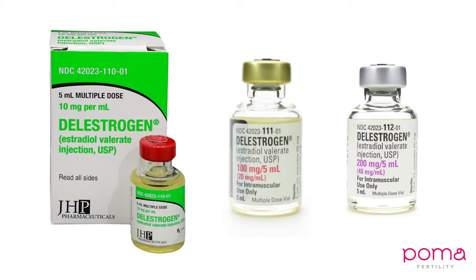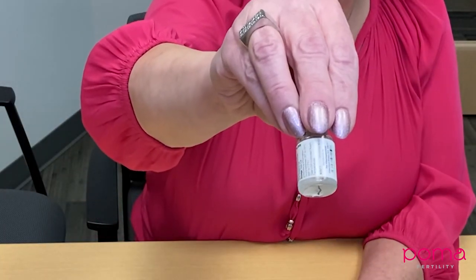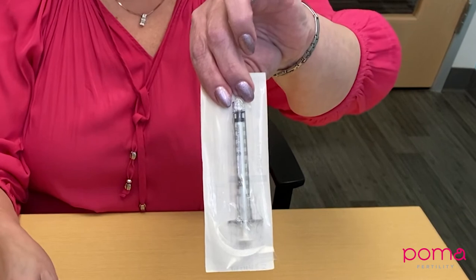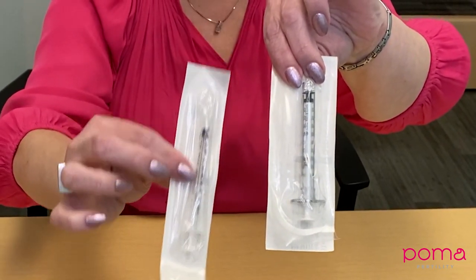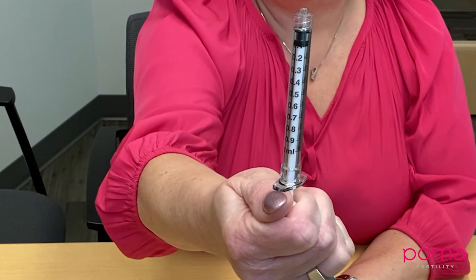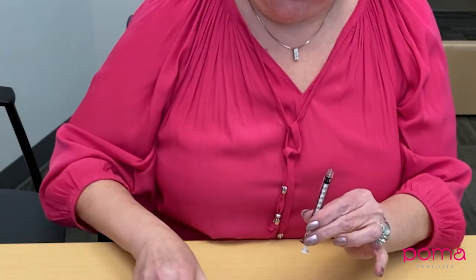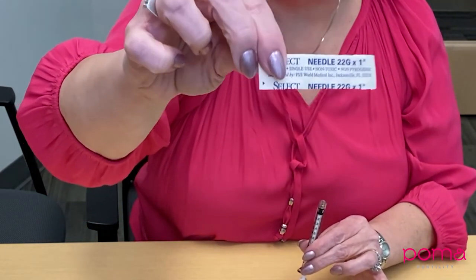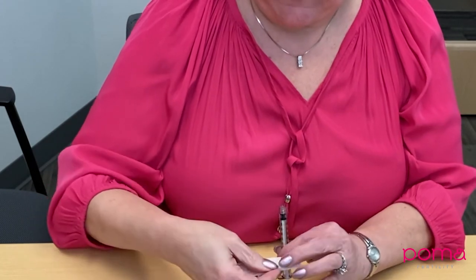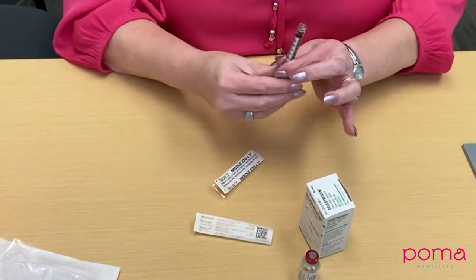What you will need is your Delestrogen vial, a 1 cc syringe — it will look either like this or like this, but what's important is that your syringe has numbers that say 0.1, 0.2, 0.3, and it's a 1 ml syringe. In addition, you will need a draw needle, typically a 22 gauge, and a 25 gauge one inch needle for giving.